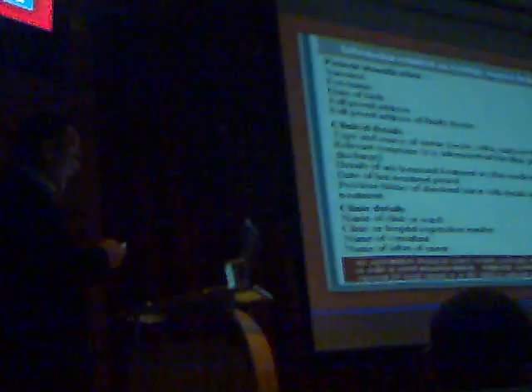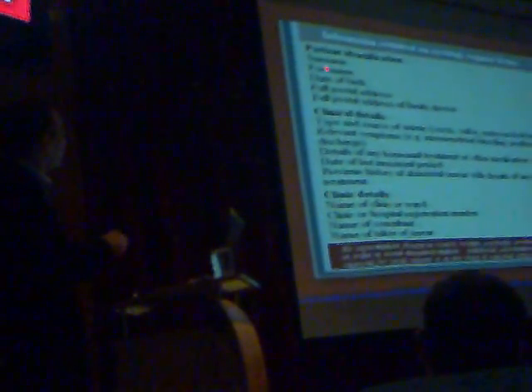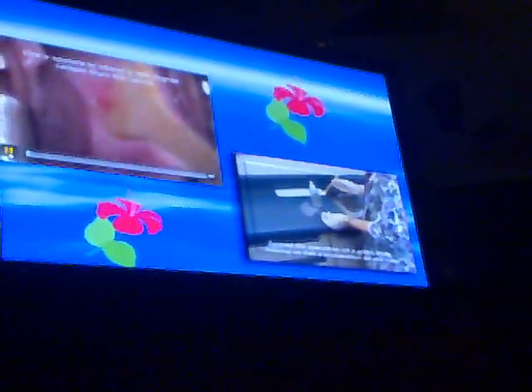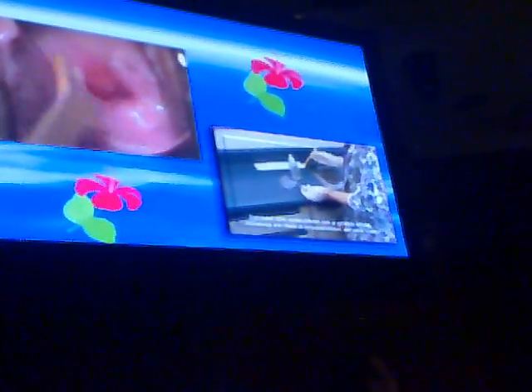After that, I will review the request form. Very important data must be written, including clinical patient information and clinical details, and sent to our colleague, the cytologist. I need to concentrate on the 360 degree rotation. Some mistakes in this video: rotation of more than 360 degrees, and the brush inserted more than 1/8 of the way.